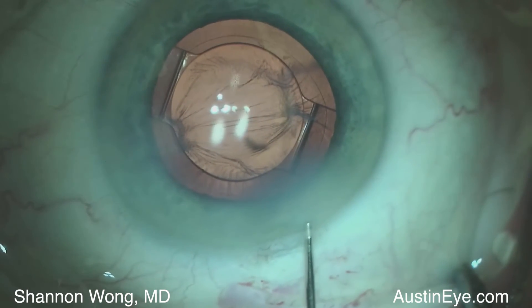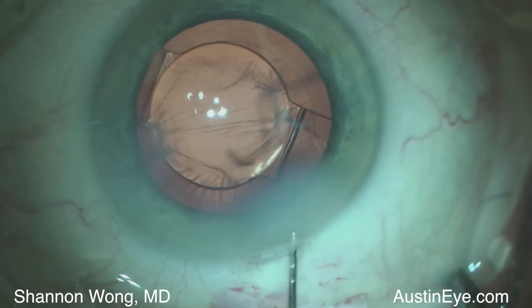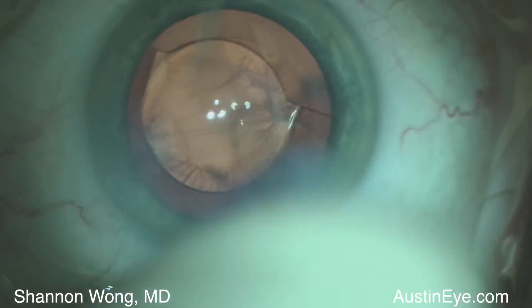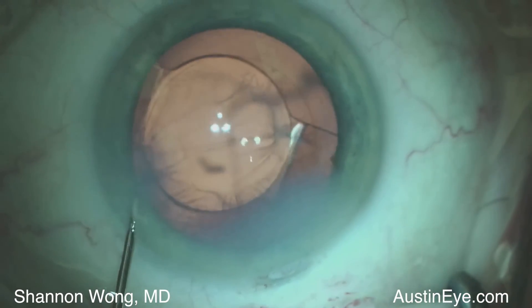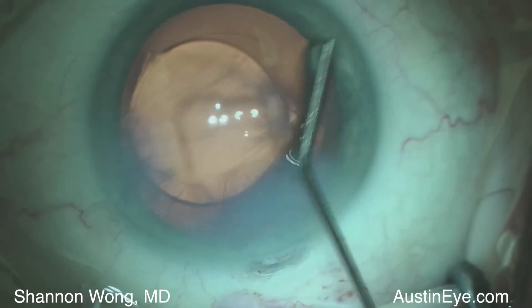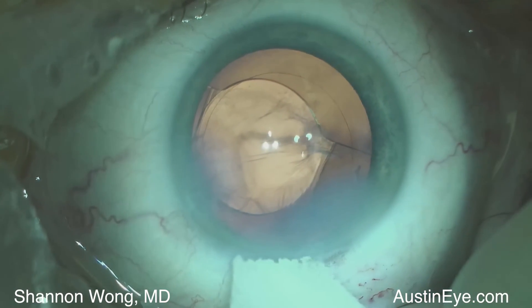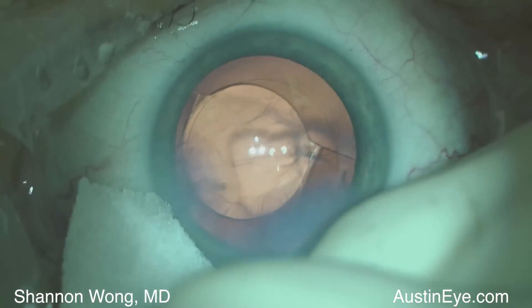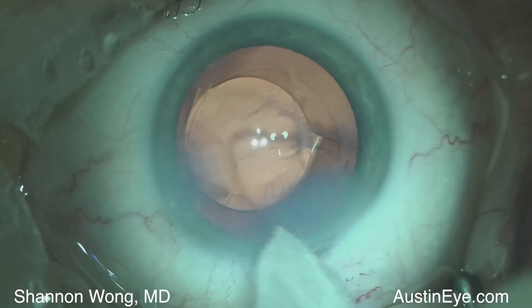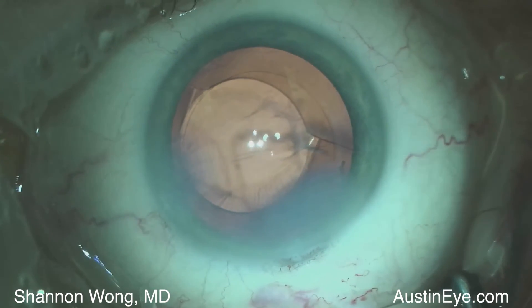In this configuration we see that the optic of the Crystal lens is planar. Both haptics are flat and pointing toward the macula, which is the correct orientation of the Crystal lens. We confirmed that we have watertight closure, and this patient did quite well and regained uncorrected 20/20 vision by the following day. Thank you for your time and attention.